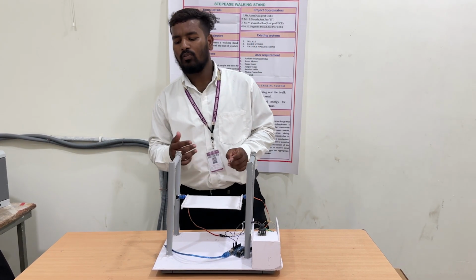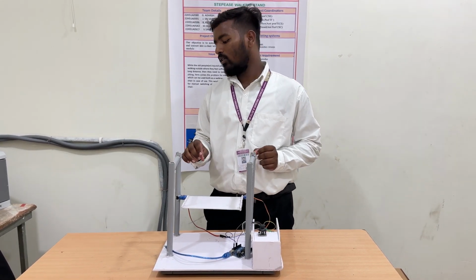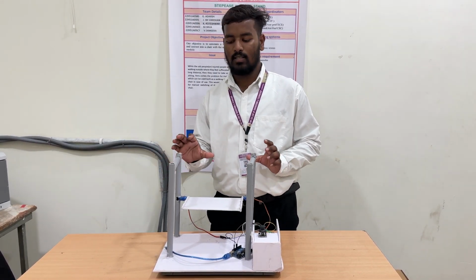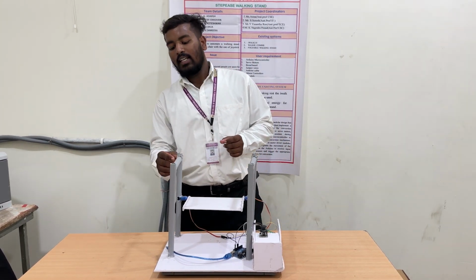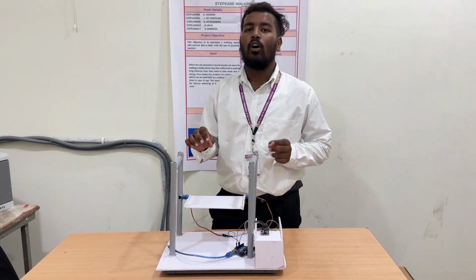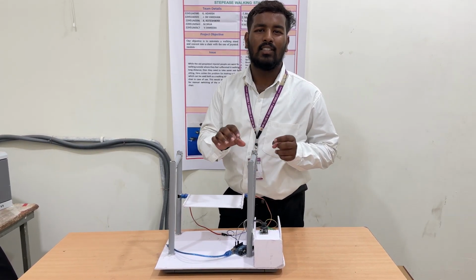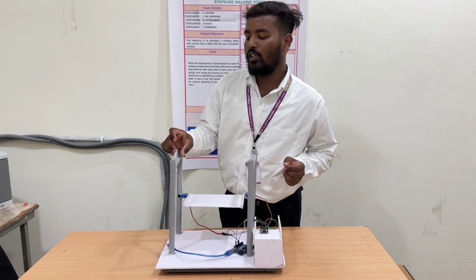And the future scopes of this project are that we can add a few sensors like IR sensors or other sensors to sense the objects or anything around this. And we can add a few features like reading the body temperature or fat burn in the body.